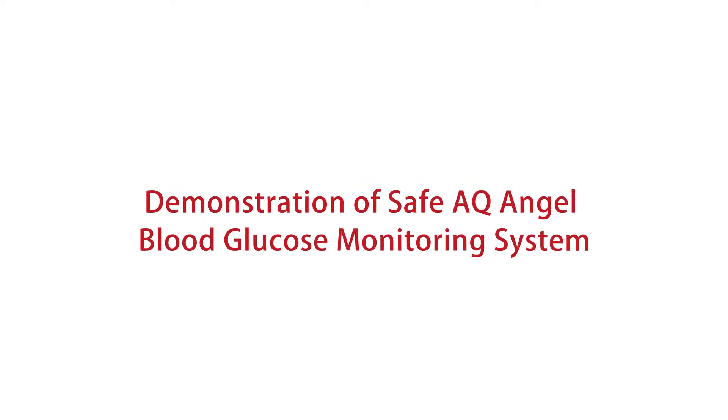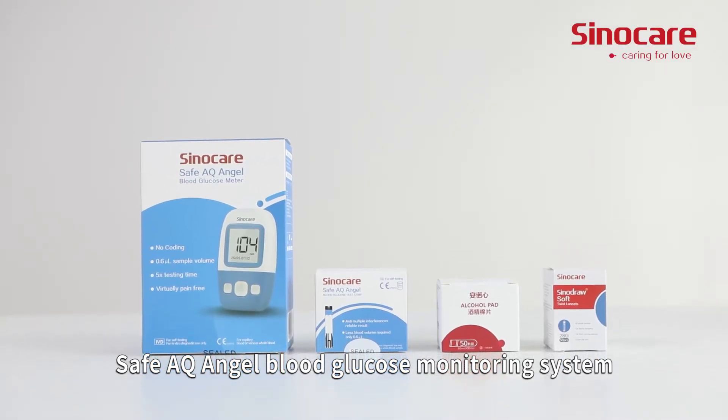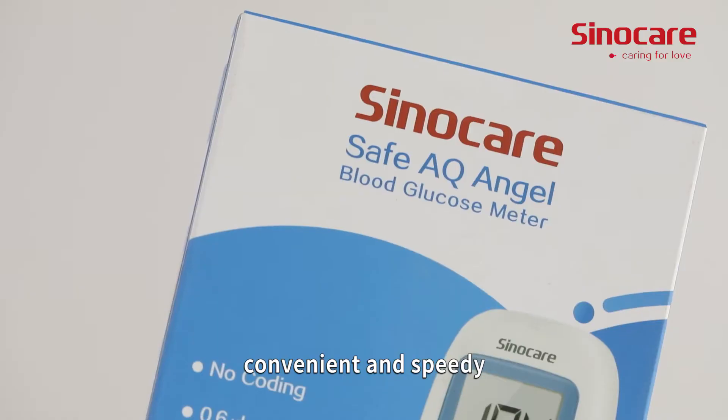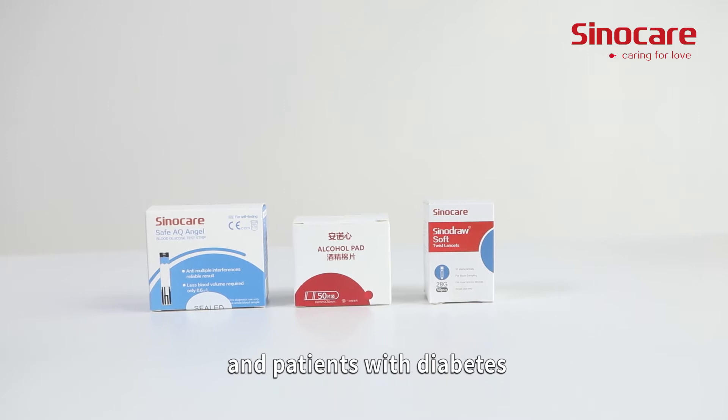Demonstration of SAFE-AQ Angel Blood Glucose Monitoring System. The SAFE-AQ Angel Blood Glucose Monitoring System is easy to operate, convenient, and speedy. It can be applied to medical organizations and patients with diabetes.